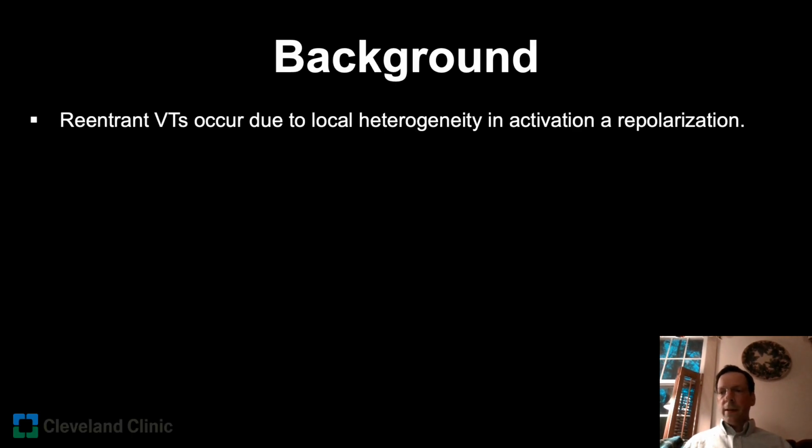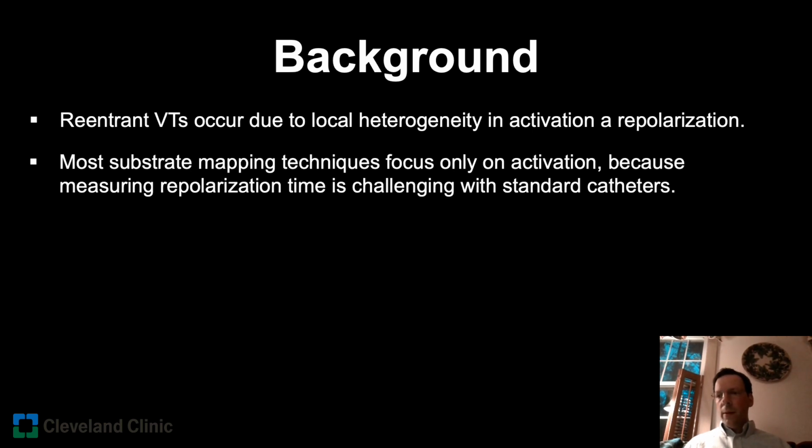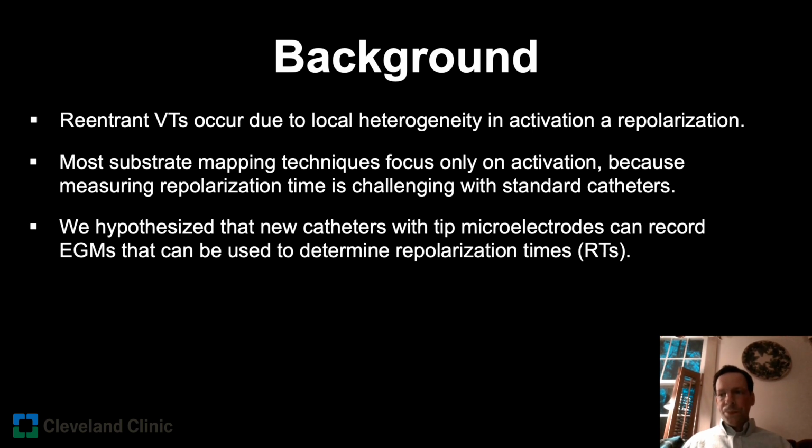Reentrant ventricular tachycardias depend on local heterogeneity and activation, as well as repolarization. Contemporary mapping techniques generally focus on activation only. Assessment of repolarization using standard catheters is quite challenging.